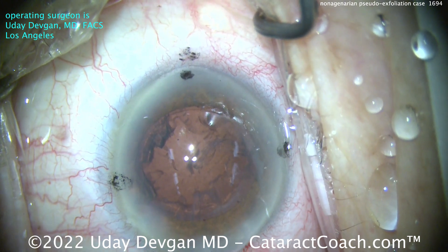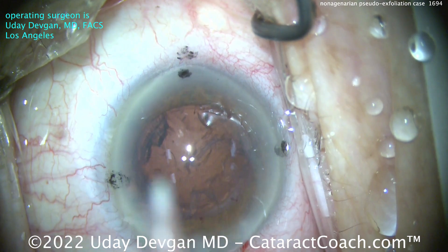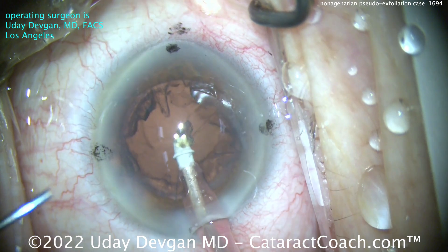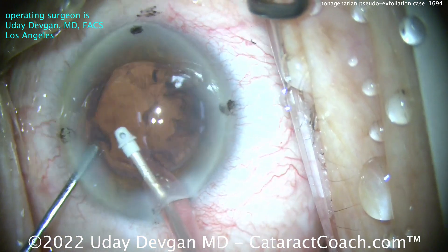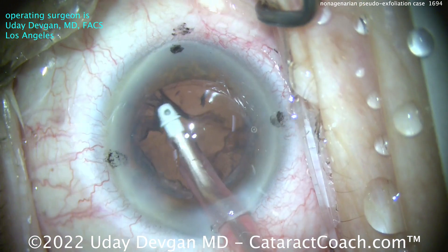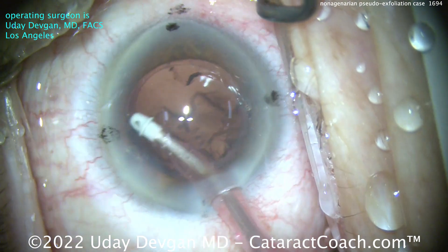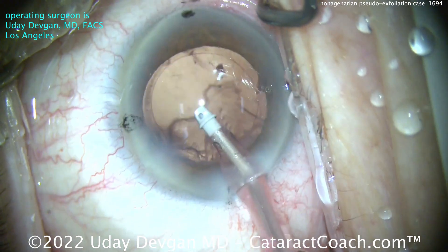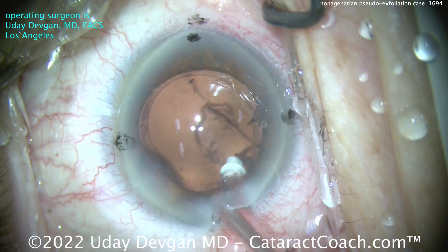Time for some cortex removal. The patient did get a little bit of systemic sedation — one milligram of intravenous Versed, which is midazolam. That's a very short-acting benzodiazepine which will give the patient just enough to take the edge off. You don't want to give too much sedation in these 90-plus-year-olds, as their therapeutic window is very narrow. So cleaning up the cortex here — we're not going to go overboard on too much polishing, just want to get it pretty cleaned up.